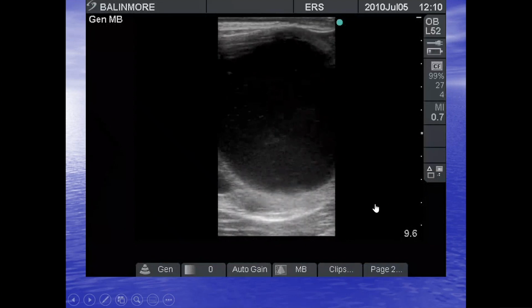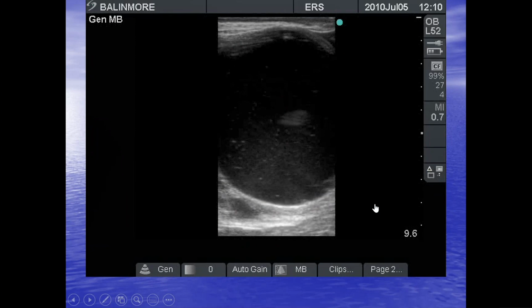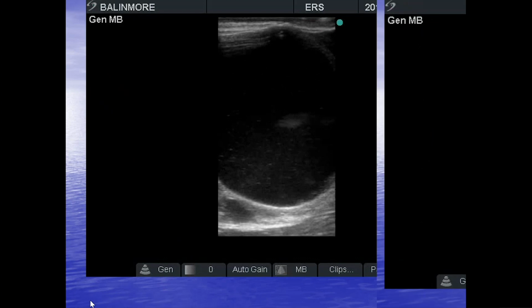If we look at some video clips, look, here's a mare. Is that a hemorrhagic follicle, or is it a follicle going to ovulate normally? Look, you've even got this sort of, I presume, fibrin blood clot within it. Is that a normal mare or not? Look at your scale, 9.6. So this is a 1, 2, 3, 4, 5, 6, 7, nearly 8 centimeters, this follicle. Yeah, I'm putting that in the category of anovulatory hemorrhagic follicle.